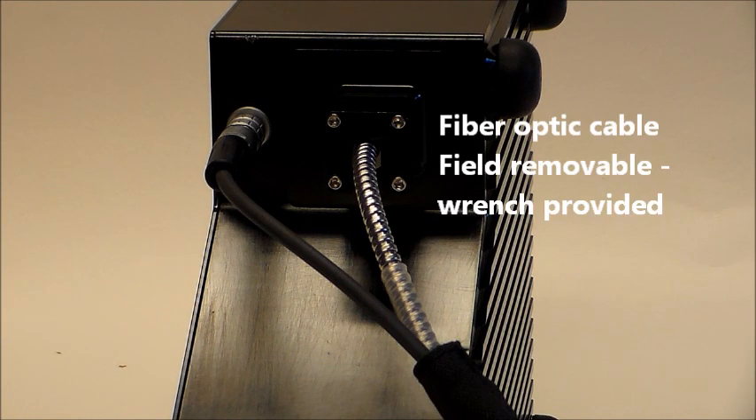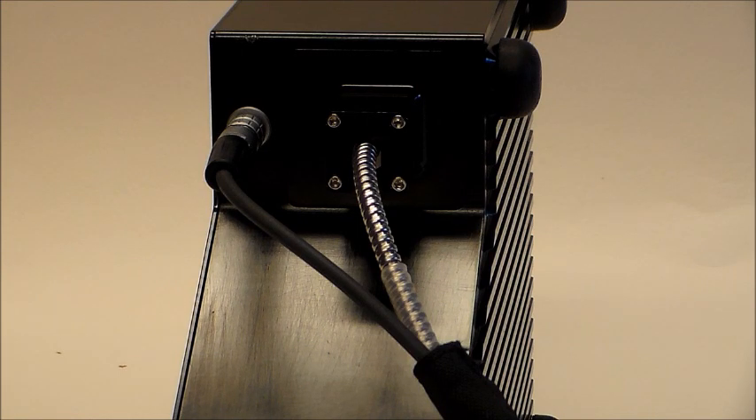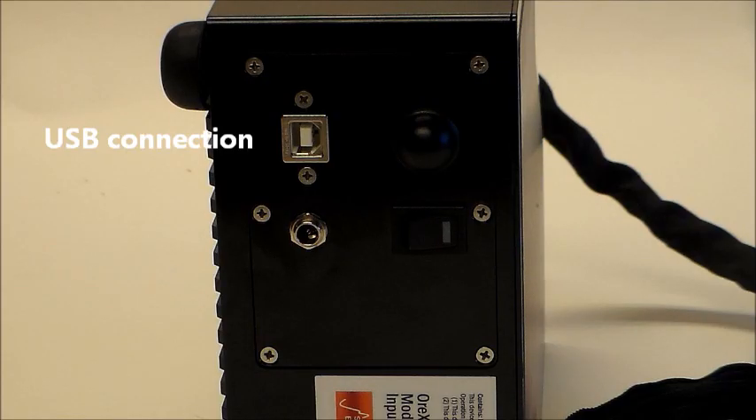The fiber-optic cable is field removable and a wrench is provided with the instrument. On the back is a USB connection for a laptop, a power connection where the cable from the battery is attached, a Bluetooth antenna, and an on-off switch.